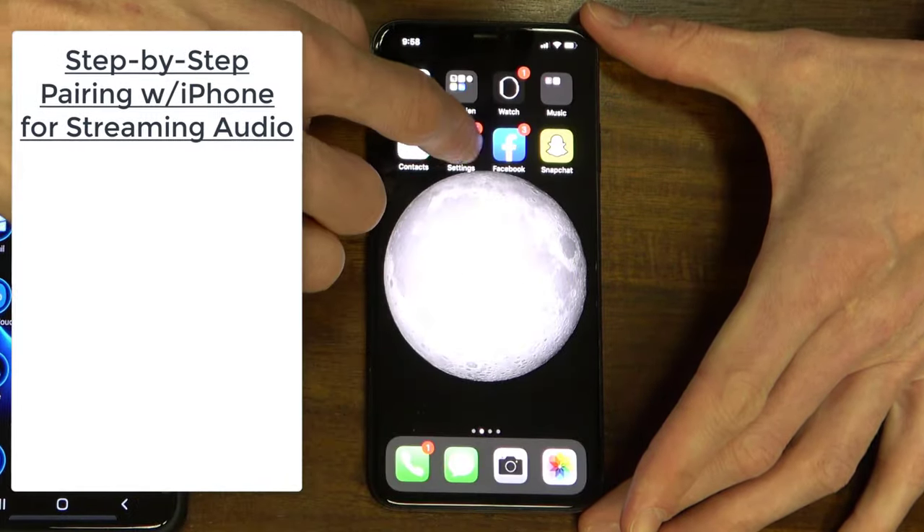Next, I'm going to show you how to pair a made-for-iPhone hearing aid. There's an important distinction: if you want to do streaming, you have to have an iPhone to do streaming with these hearing aids. However, if you just want to connect to an app to make remote control adjustments like volume or program changes, you can use an Android phone for that as well. For now, I'm going to show you how to connect these made-for-iPhone hearing aids directly to an iPhone.